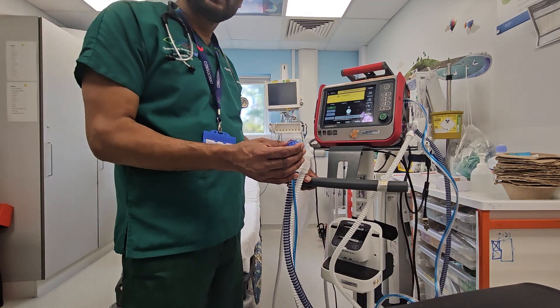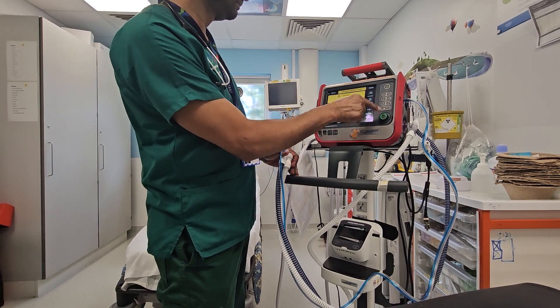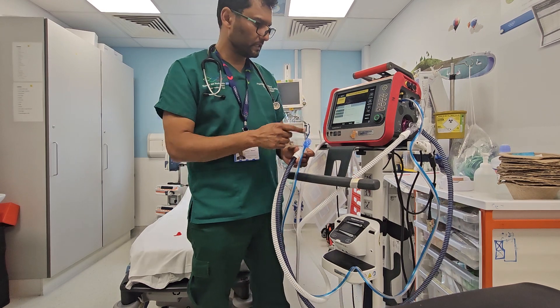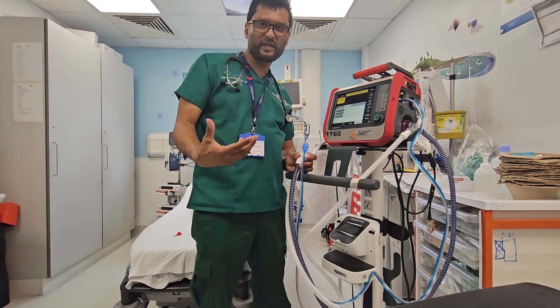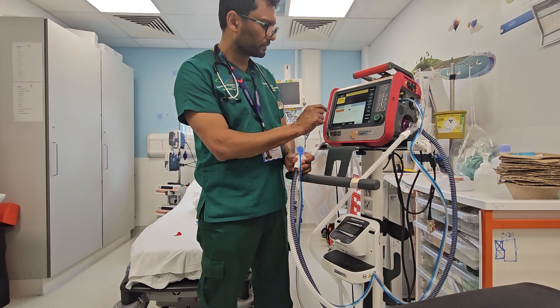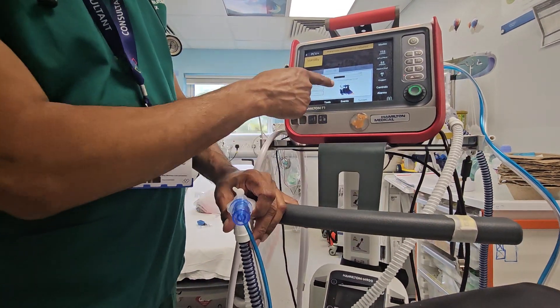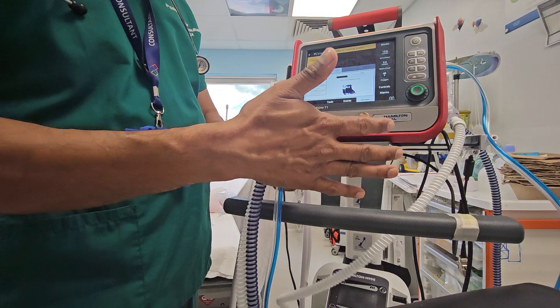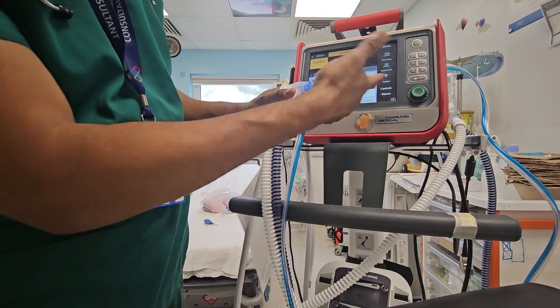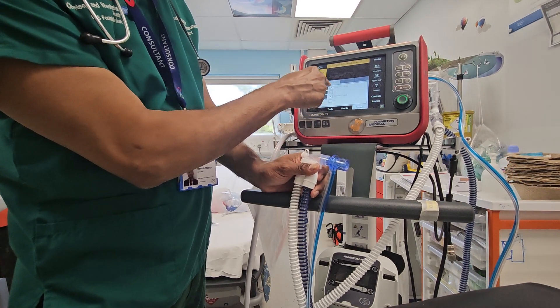At this stage we start the pre-use check, which is basically a leak test. It has to be calibrated every time before you use it — this takes about five to six minutes. Click on leak test. It says 'block breathing circuit,' so I block it. Then it says 'reconnect breathing circuit,' so I take my hand off. It gets a tick here — that means it's all done.